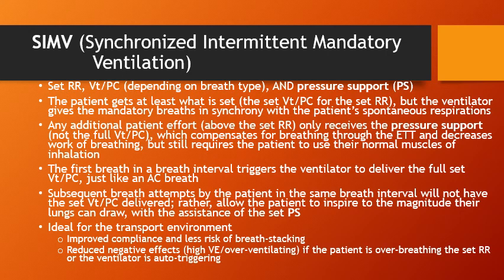It's only getting that little extra help of the pressure support. So there's not nearly as high a risk of overventilating the patient if they're tachypneic, or if the ventilator starts to auto-trigger, it's not going to give them these huge extra tidal volume breaths that result in way too high minute ventilations.